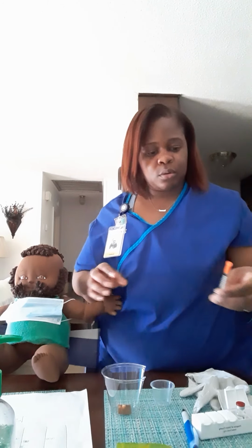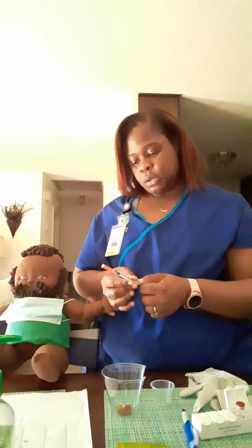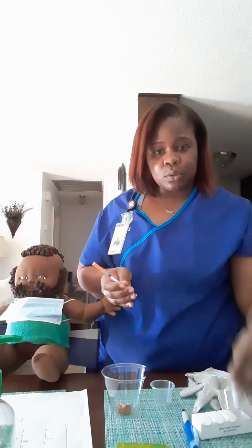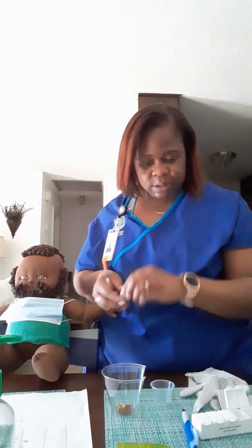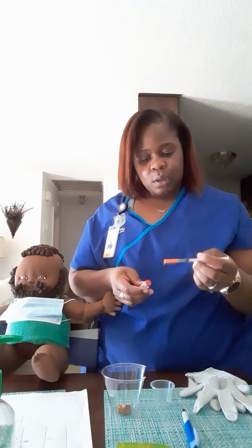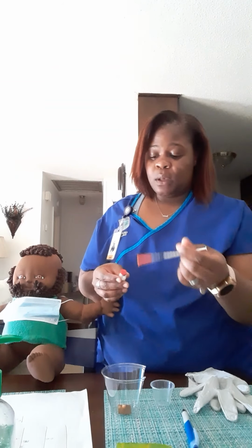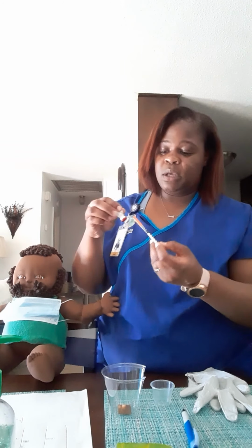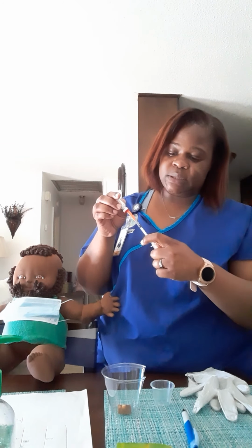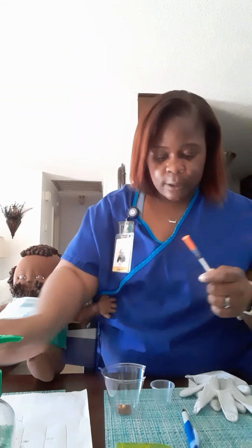And then for my Lantus, I'm going to draw it up to 26 units. I'm going to pull my Lantus from the Pyxis. I will take this cap off and clean it with alcohol. I've pulled back 26 units of air. I would insert the needle, invert it, push the air in, and then I would pull back, pulling out 26 units of Lantus. Done with that.